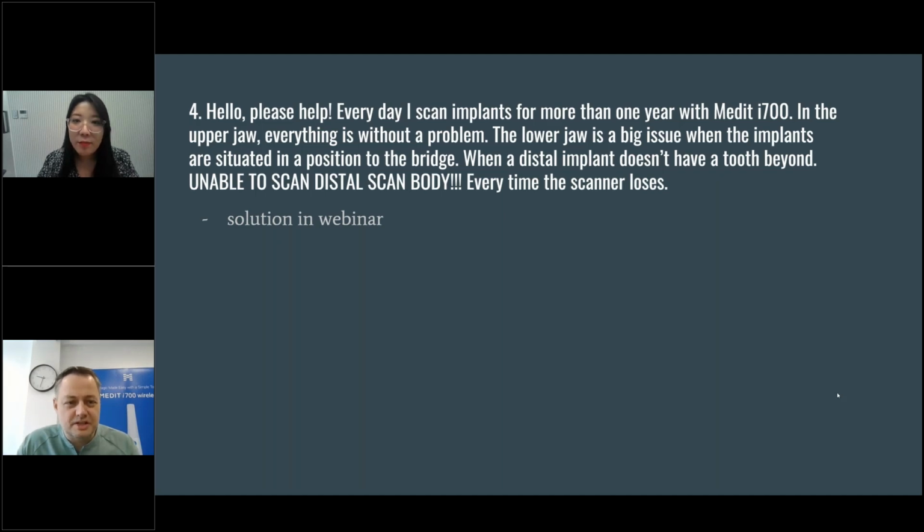Yes, of course. It's the third way I teach in this webinar to scan scan bodies, and in this direction, what I should say is that I always tend to not use composite resin, because composite resin is very prone to be moved by the tissues, and I use resin modified glass ionomer cements because they are hydrophilic. The important thing when you place the resin, I have to mention, this glass ionomer that I use has to stay only on the fixed gingiva.